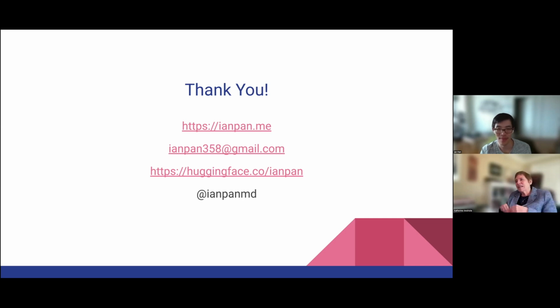Yeah, great. And Khalid Yunus here, who was a member of the team that developed the pneumothorax detection algorithm with GE Healthcare. One of the challenges that they faced was that competition-winning solutions often overestimate performance metrics like area under the curve, AUC, without considering computational costs. Although I believe there's a limit on the computation for these challenges, such as inference time. And this tends to favor ensemble models that achieve high scores but are impractical for real world deployment.